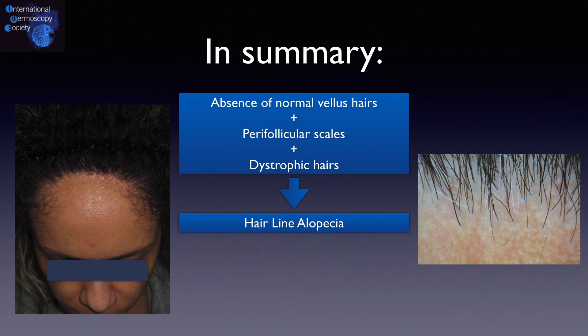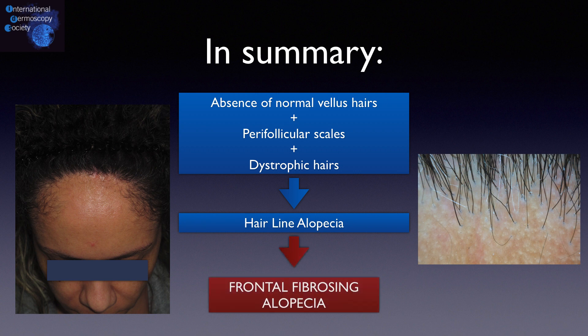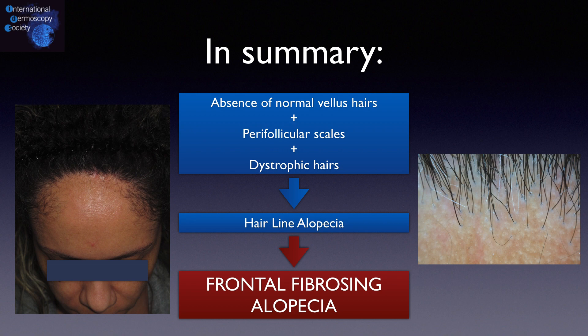In summary, the absence of normal vellus hairs, perifollicular scales, and dystrophic hairs in the frontal hairline is suggestive of frontal fibrosing alopecia.